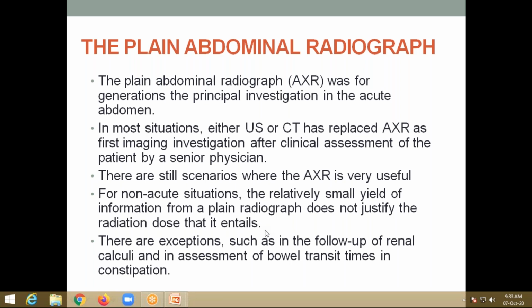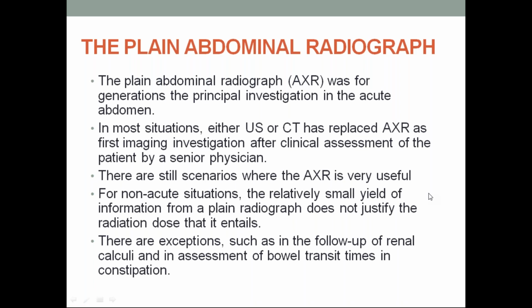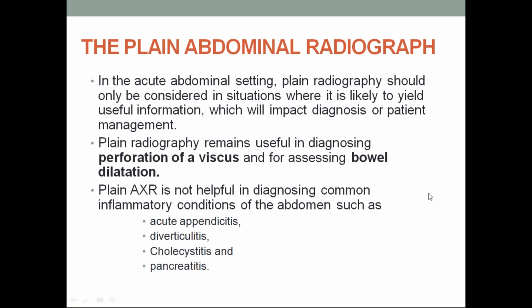There are exceptions, such as in the follow-up of renal calculi, which are sometimes visible on abdominal radiograph, and in assessment of bowel transit times in constipation. Coming after that, in the acute abdominal setting, the plain radiograph should only be considered in situations where it is likely to yield very useful information, which will impact the diagnosis and the management of the patient.